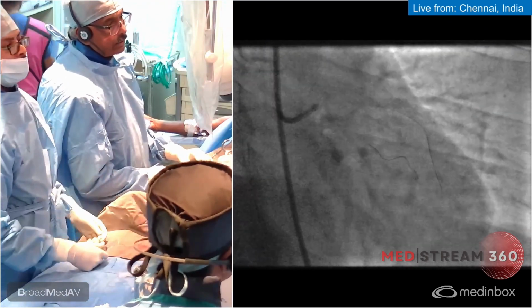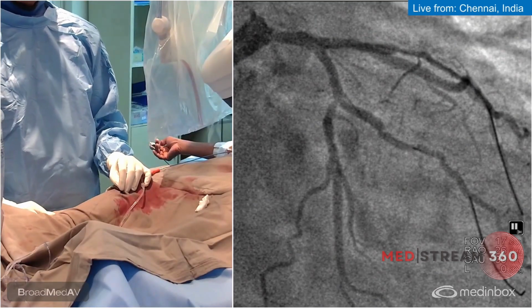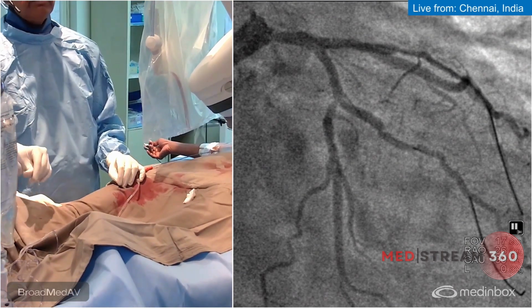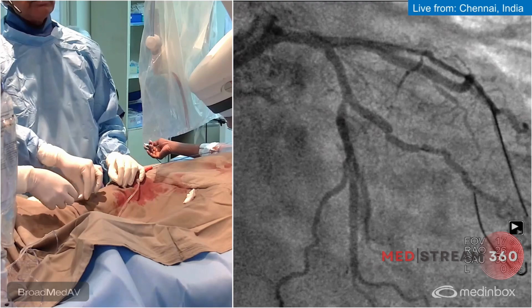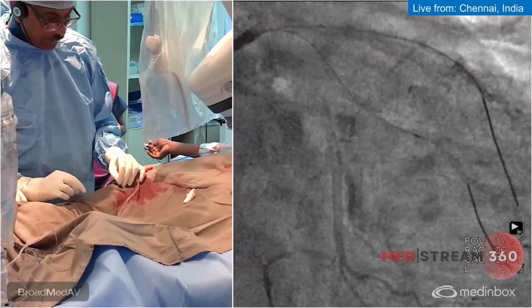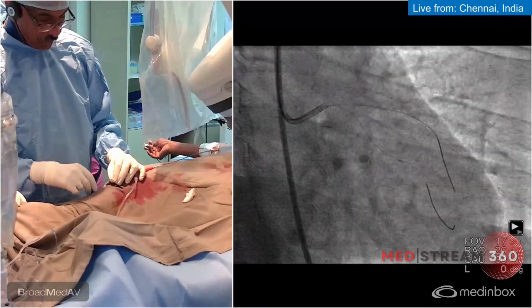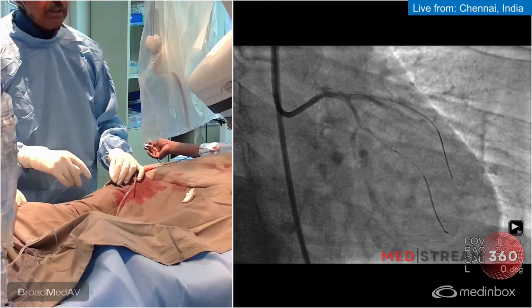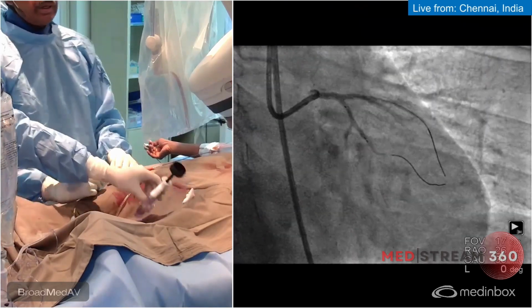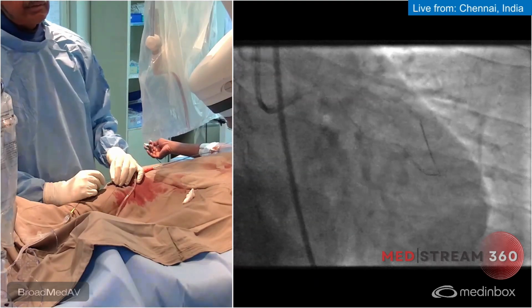Don't like that. So the plan was to fix the OM first, because in case you cross over into the left main, and you can see that the left main is diseased even on the angiogram to the ostium, then we'll have difficulty doing all this at that point of time. So what we're going to do is now fix the OM and then come back and fix the LAD after that. So this is a 2.25 by 15 Onyx stent. Okay, that looks good. I'm going to go up there. Go to nominal, please.